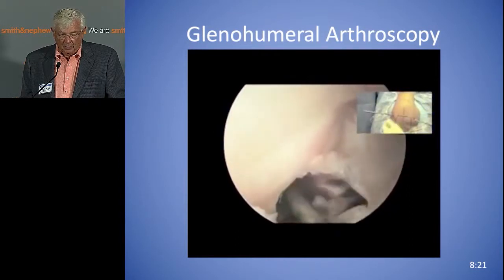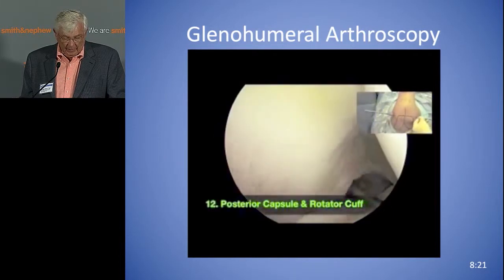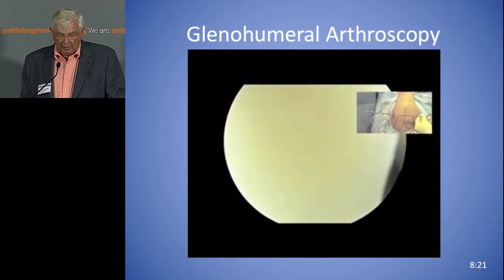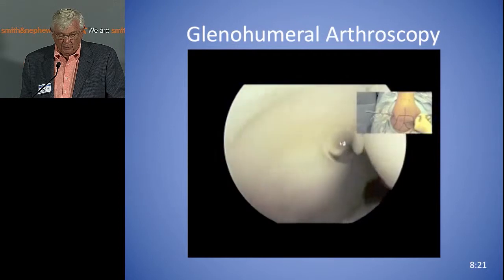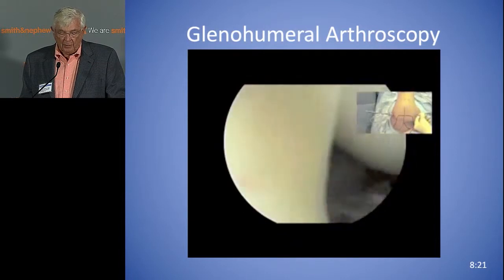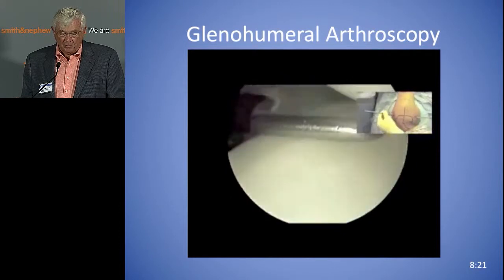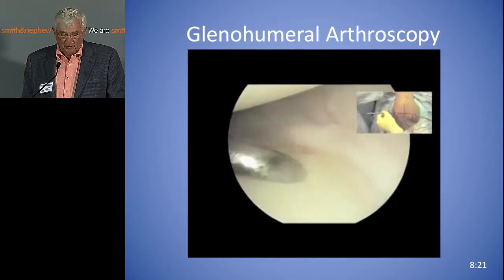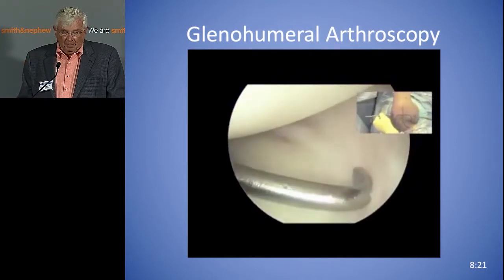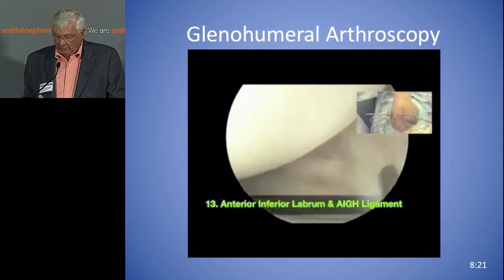Now you can look up at the posterior part of the cuff and look at the posterior capsule. The biceps tendon is on the left, humeral head is on the right. Now you can duck right under the biceps tendon. Look up at the cuff — things look different, but if you're going to have a fellowship and do sports medicine shoulder surgery, you should be able to operate with rhythm and style and look smooth in what you're doing. Now you can look down at the anterior inferior labrum and the glenohumeral ligament.